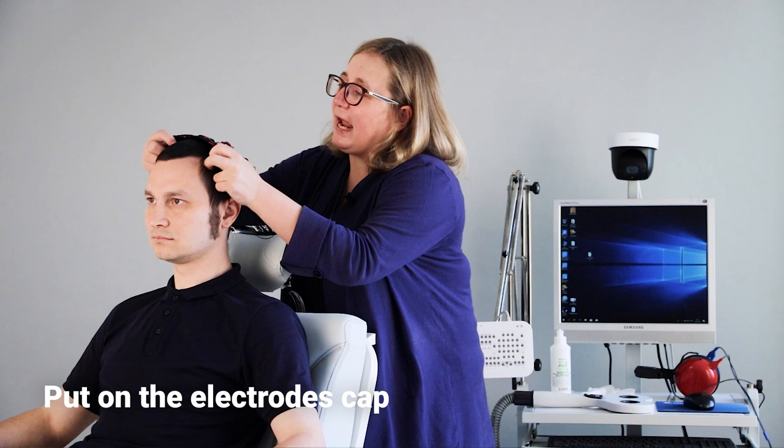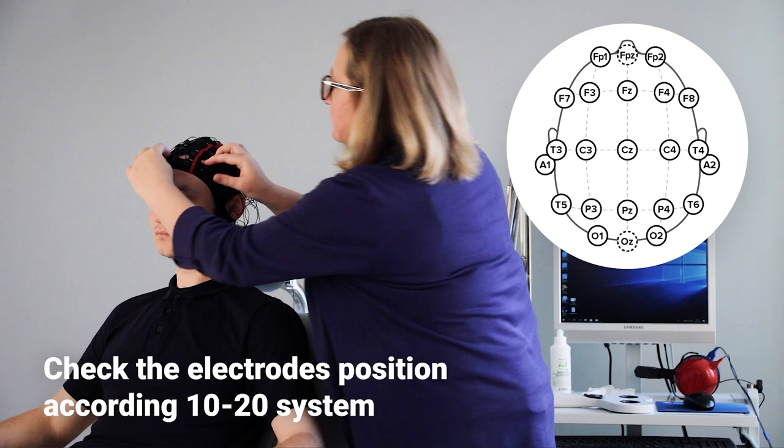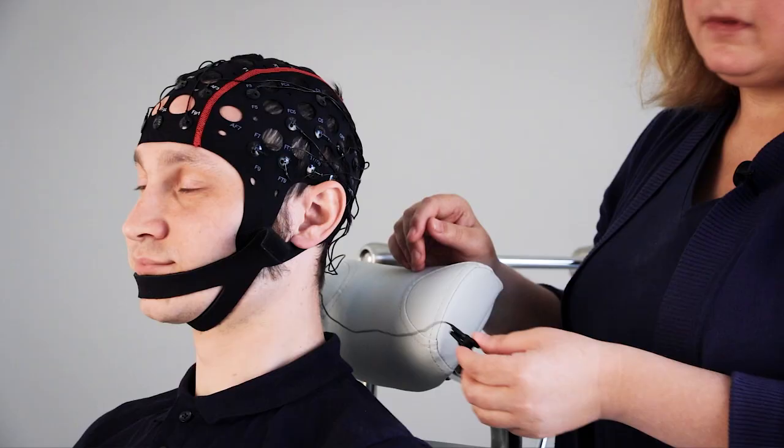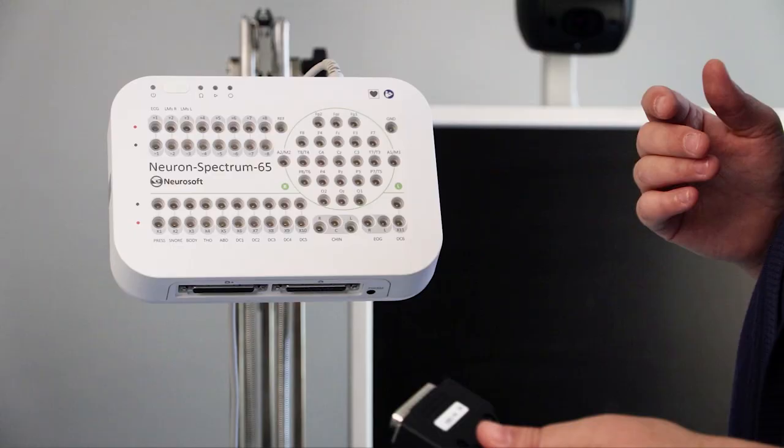I put the cap on the patient's head and check the electrode position according to the 10-20 system. Don't forget about the earlobe electrode. I connect the electrode cap to the EEG amplifier.